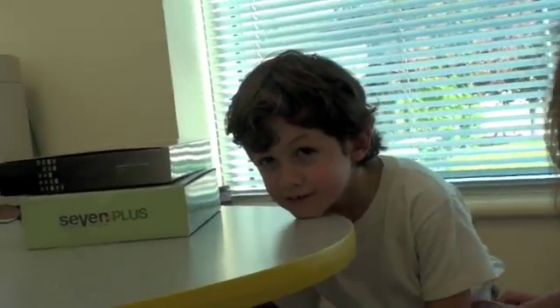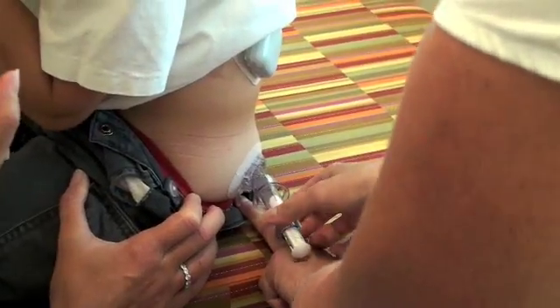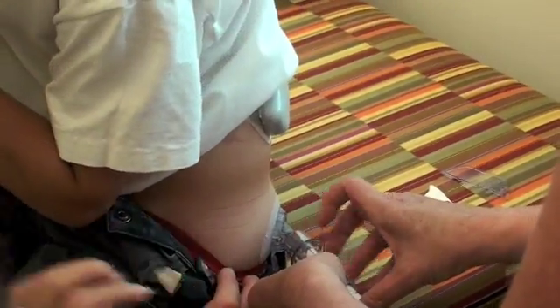I'm not doing anything. I'm recording you — I'll tell you if I do. It's on video. I'm trying to keep this video. I have a little desperation here. Sometimes it's in a bad spot, and most of the time you don't, right? I'm going to go — one, two, three.